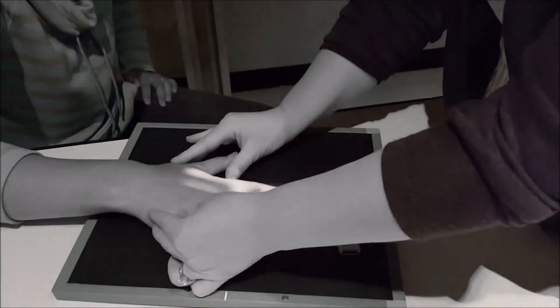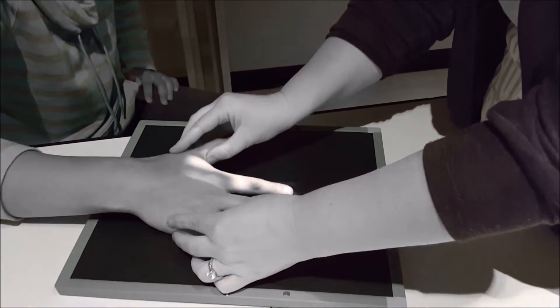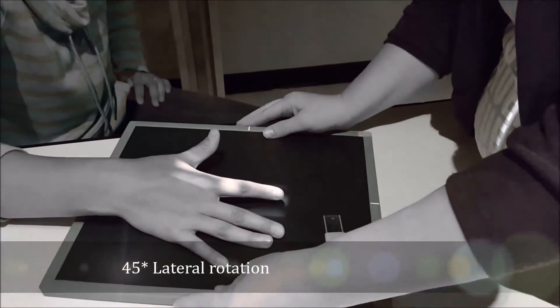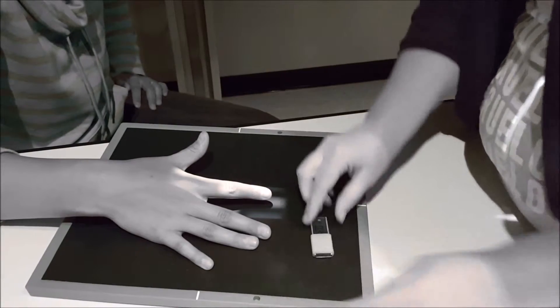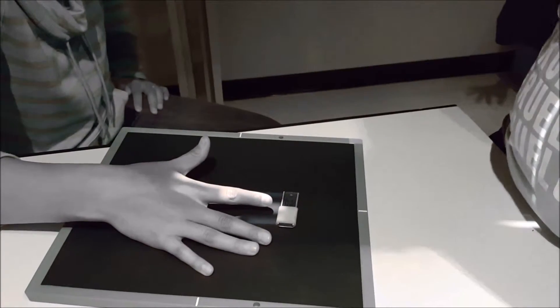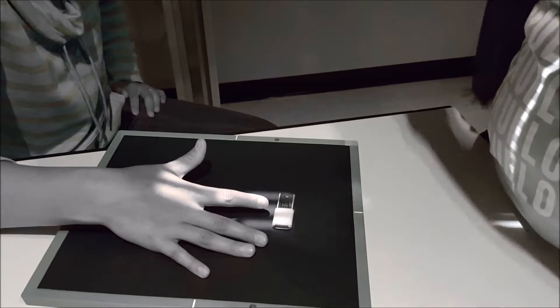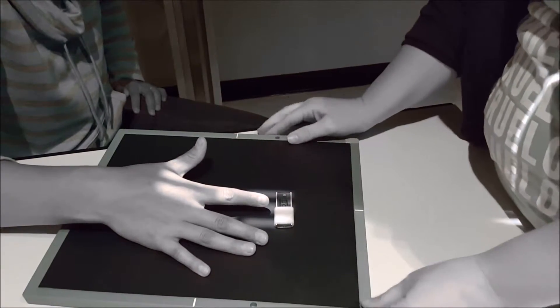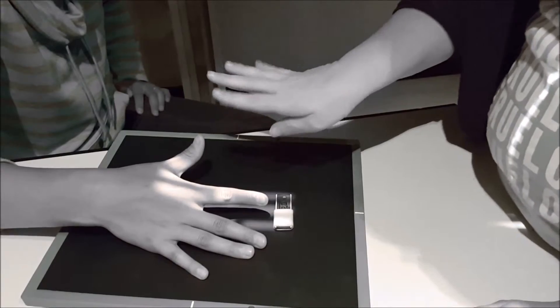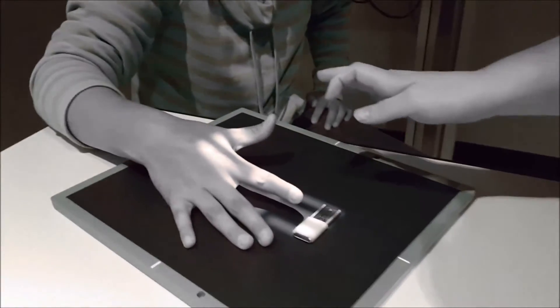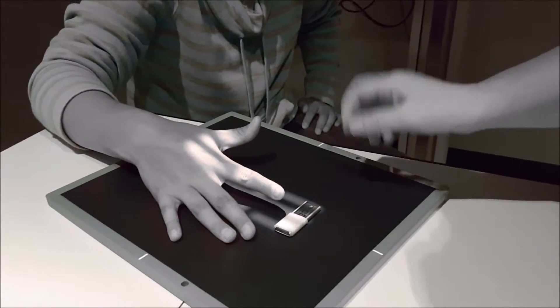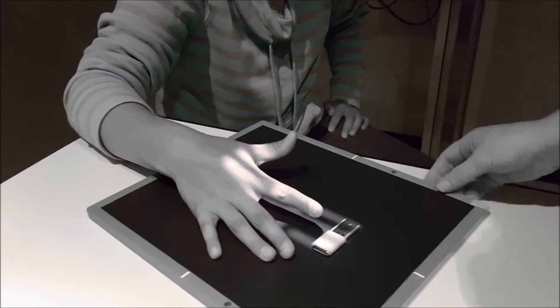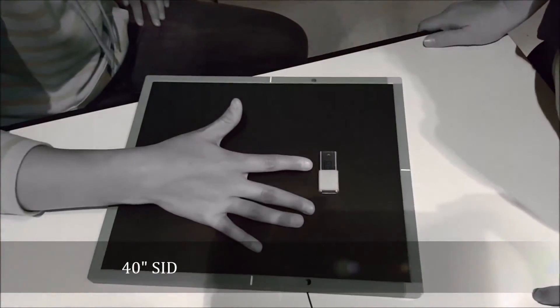Oblique digit, we're going to be 45 degrees for that digit, so that's about 45 degrees. Still centered at the PIP joint here. I'm going to have my marker right above the finger. Still it's important to keep their finger, you don't want their finger bent, you want their finger straight. Still at 40 inches, perpendicular to the PIP joint.